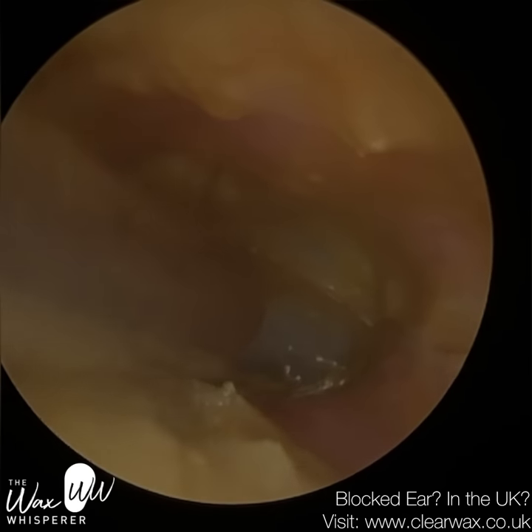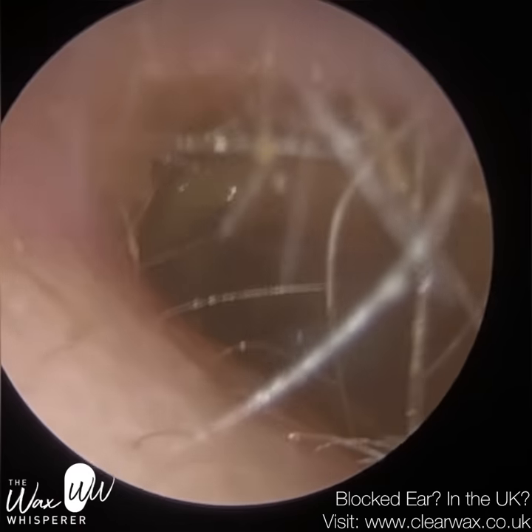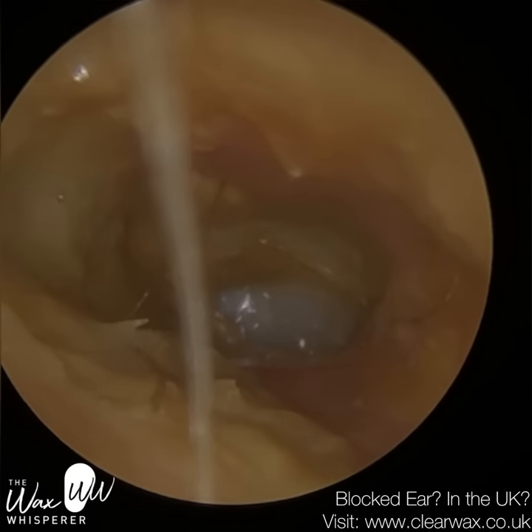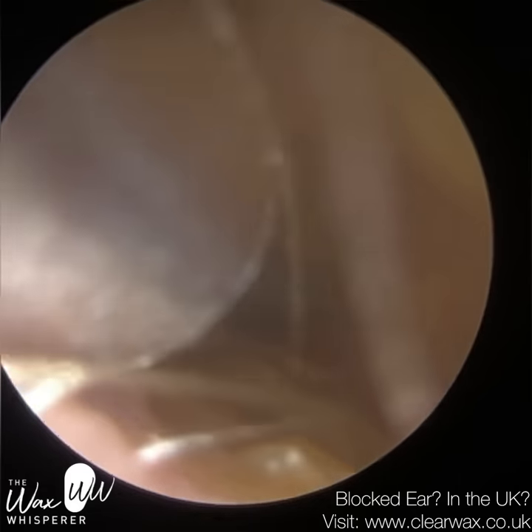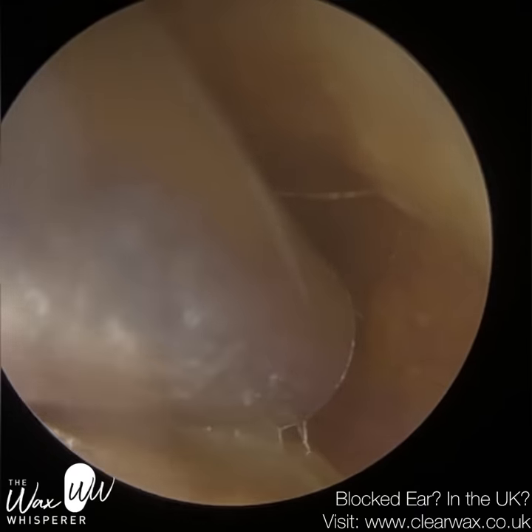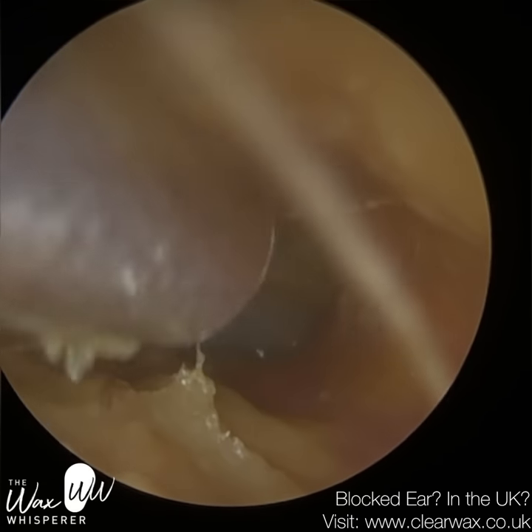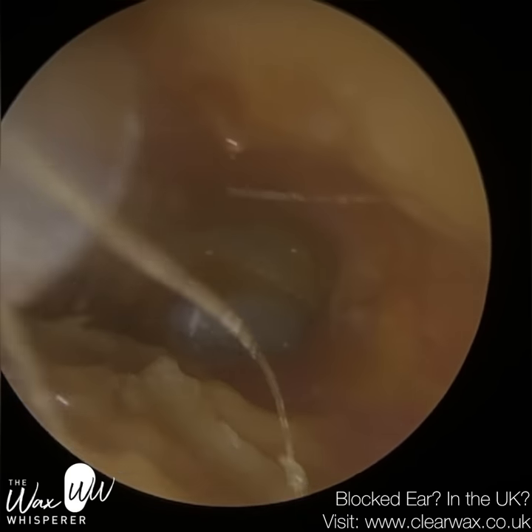Using a Jobson horn here to scrape this off — it's not going to help because first of all we're going to make contact with the canal wall, and remember this patient's got some discomfort and tenderness already, some of it on the bony part of the canal which is very sensitive. A Jobson horn is just going to spread this. Given the consistency reminds me of soft butter, using a Jobson horn is just going to spread this soft butter against the ear canal as opposed to really removing it. So I'm just going to hover over it.